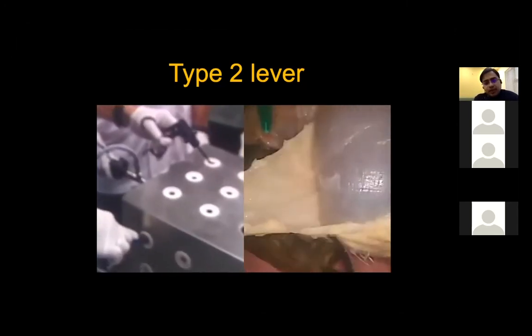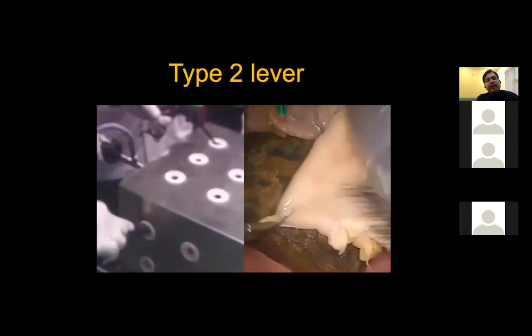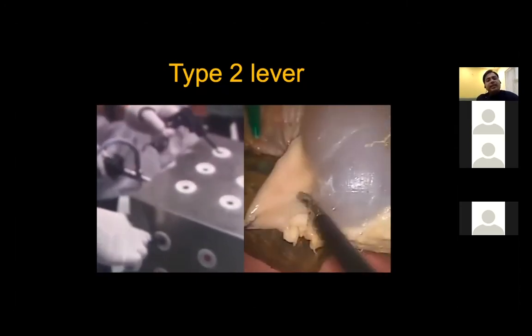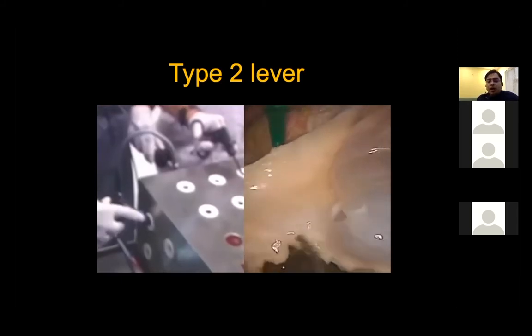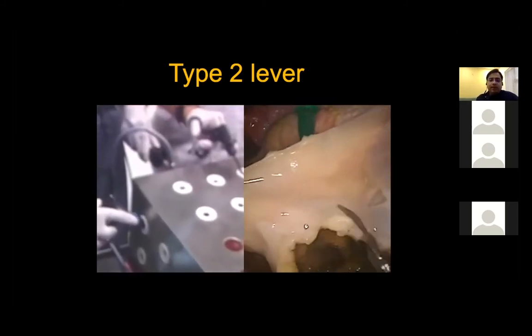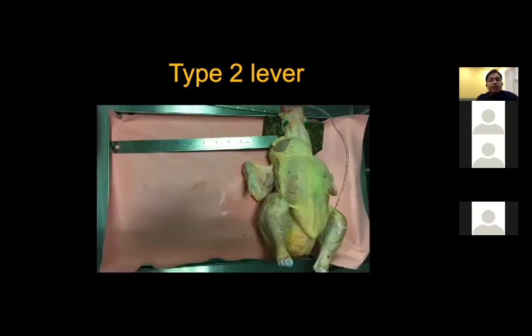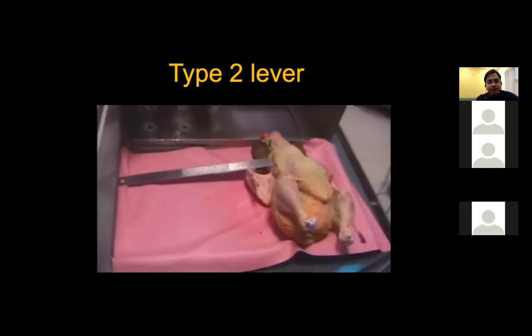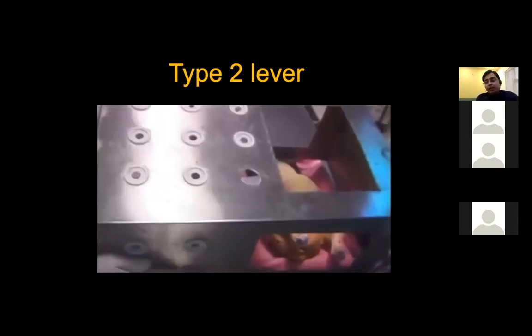Imagine a situation when you are doing a dissection of the upper pole of the left kidney. 3/4 of your right arm instrument is inside, and you are trying to push the upper pole away from the spleen. The movements are enhanced, and when you apply a small force, the tip of your instrument may just wobble and hit the diaphragm. So this is what you must avoid by placing your ports properly.